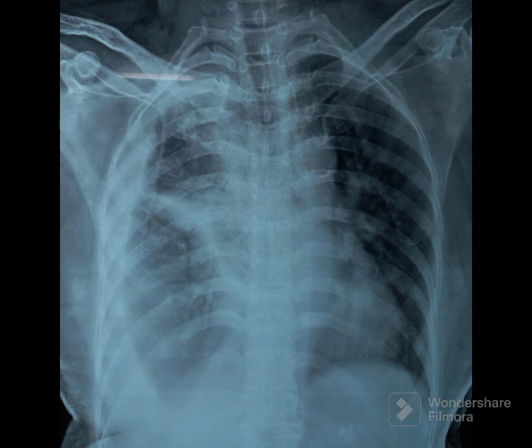Now two possibilities may be considered. One, loculated pleural effusion or collection. Second, pleural malignancy.